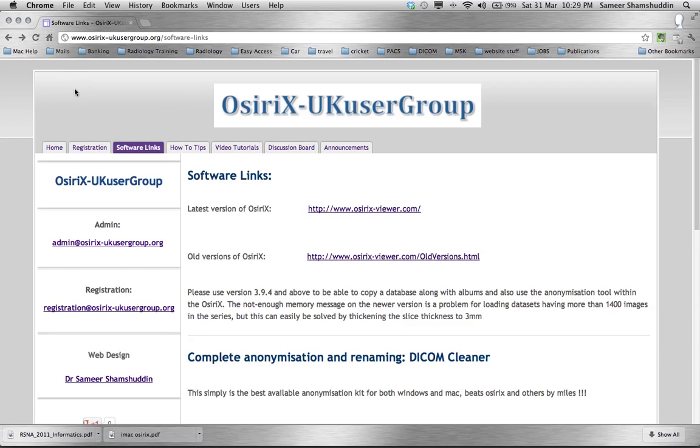Hi, this is Dr. Sameer Shamshuddin from OsiriXUKUsergroup.org. In today's video, I shall be demonstrating how to completely anonymize and rename a DICOM case using DICOM Cleaner software.